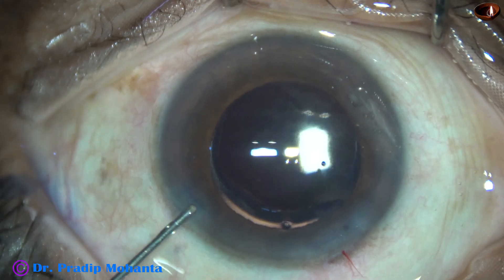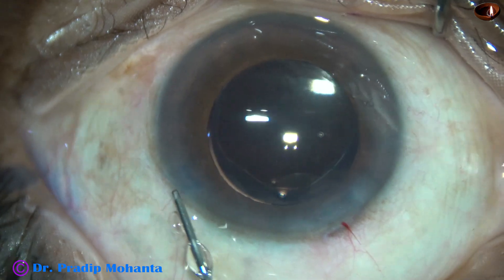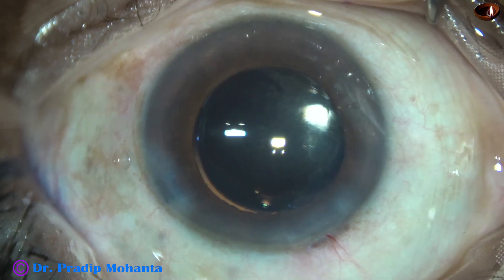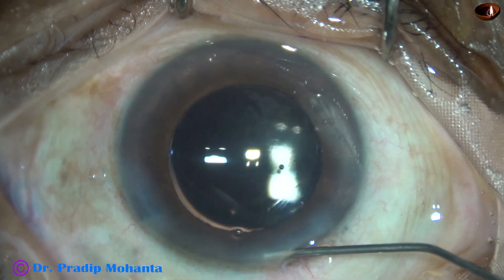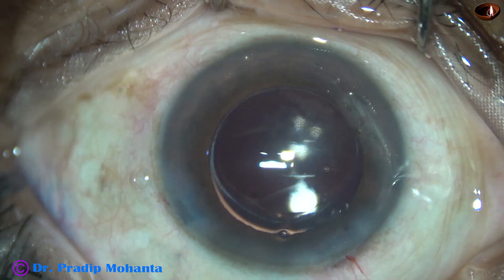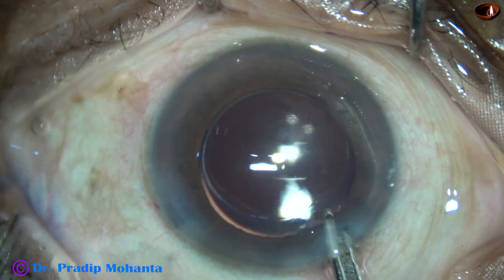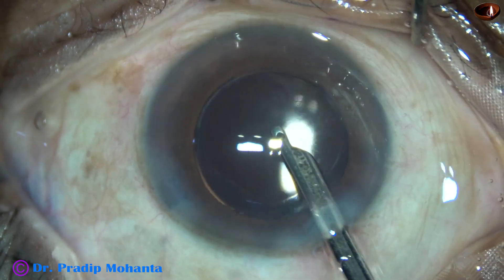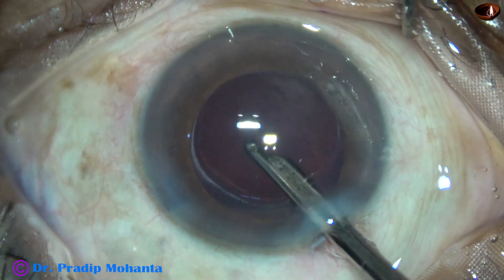This is a drop of Moxifloxacin. The side ports are closed by hydrating the corneal stroma. We made only one side port. In this case I did a little bit of hydration to the main wound because the incision was a little anteriorly placed. Now this is the final lavage of the anterior chamber.